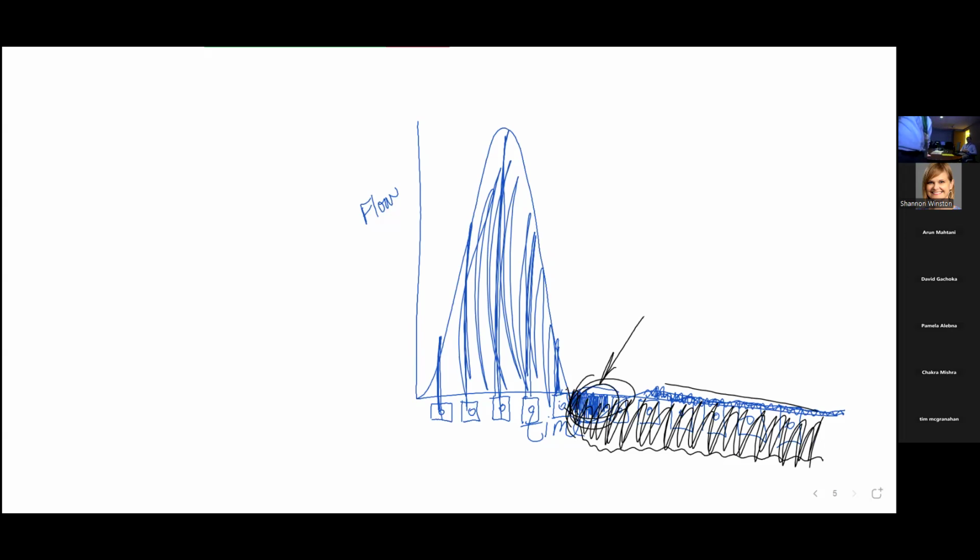And then secondly, when this was first developed, it was used to calculate coronary flows and flow reserve, just by measuring this little thing in the aorta. But since that time, there are techniques today, and they have been around for 30 years or so, where you can actually put one of those slice planes right here along the coronary artery, perpendicular to the direction of flow, and you're just fine. So, okay. That was great.